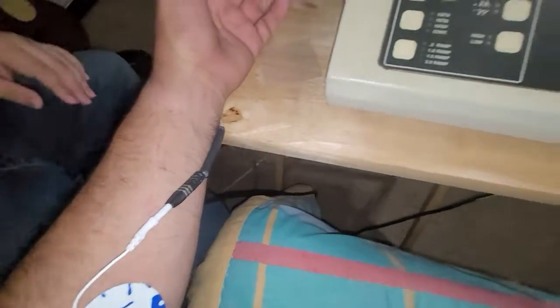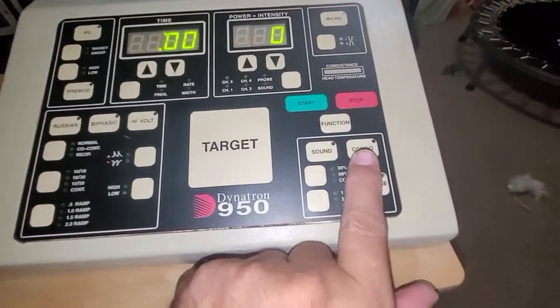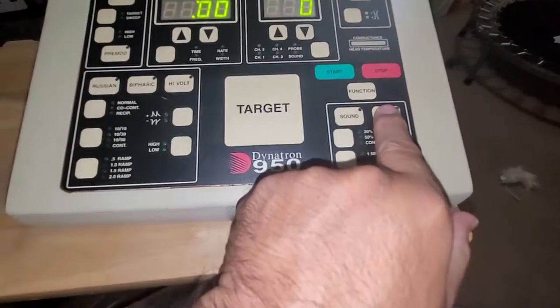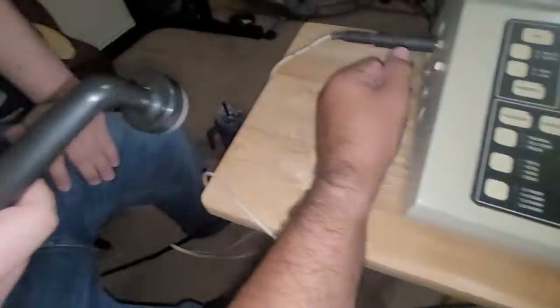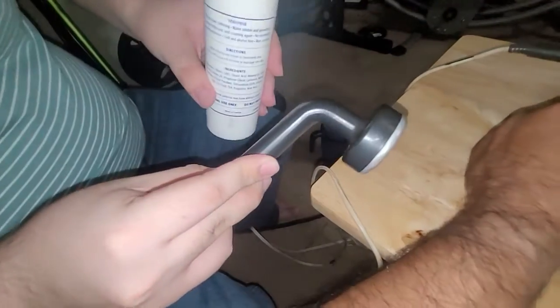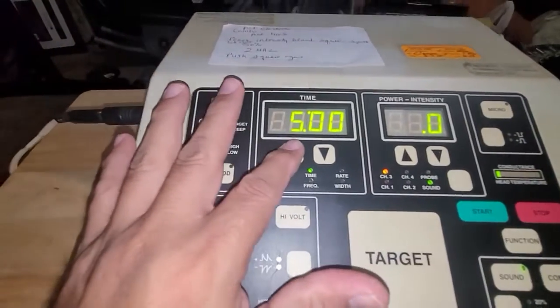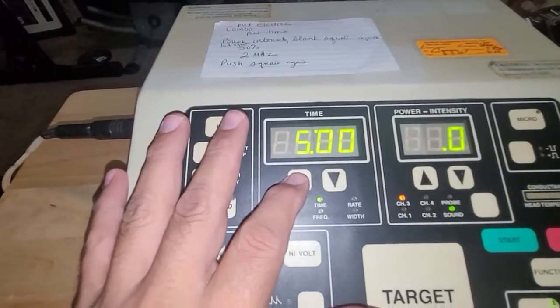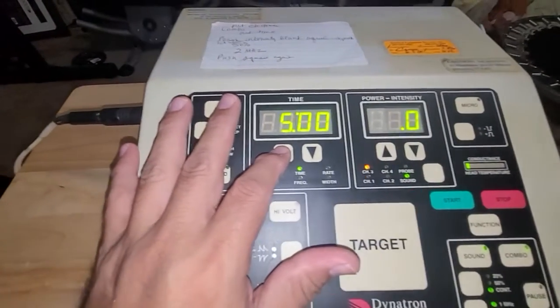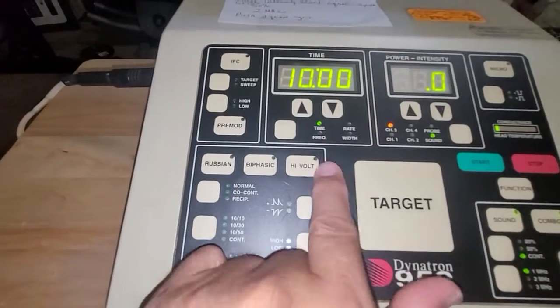of the forearm. Okay, so when we turn on the unit, you will turn on the combo for combination ultrasound E-stim. We're not worried about ultrasound, but in order to use the ultrasound head as a mobile electrode, you have to set the unit up in combo mode. The patient's treatment session will go for 24 minutes. For demonstration purposes, we're just going to leave it at 5. Well, we'll move it up to 10. And you'll see that's for the time.